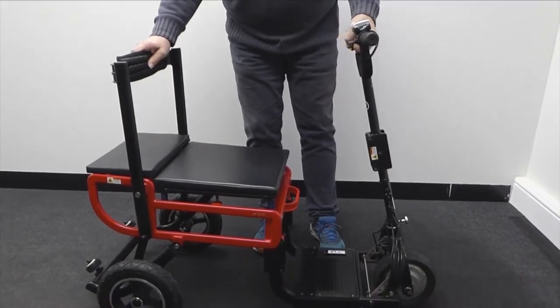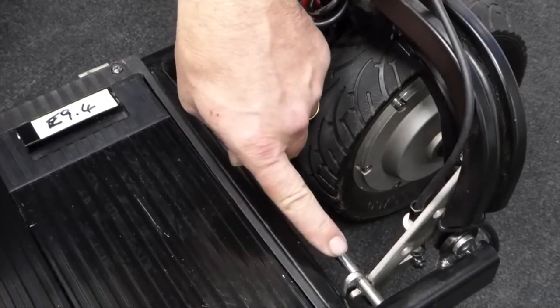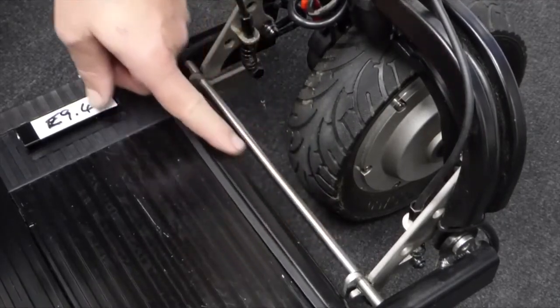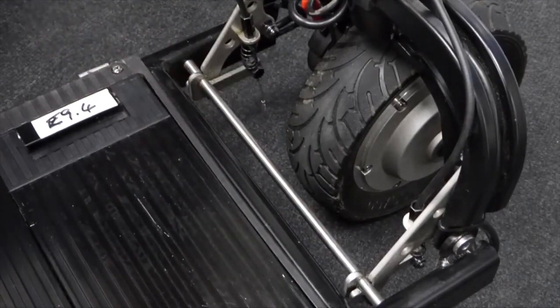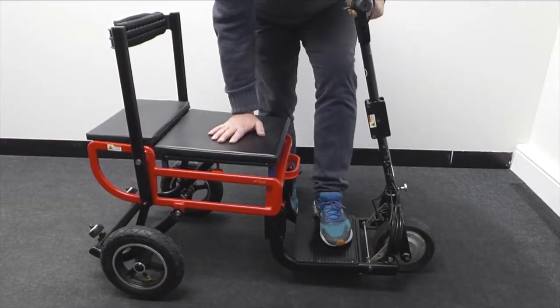Once unfolded, make sure the backrest is fully back until it stops and ensure that both of the locking catches are engaged with the locking bar. If the locking catches have not engaged, place one hand on the seat and apply pressure to the foot plate with your foot.